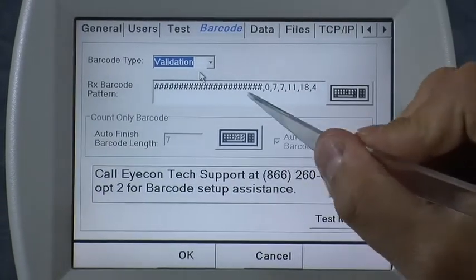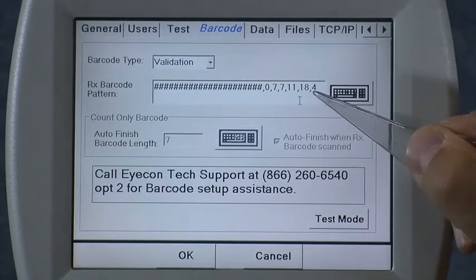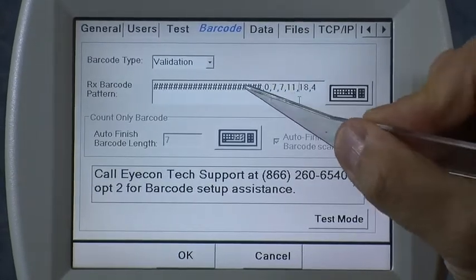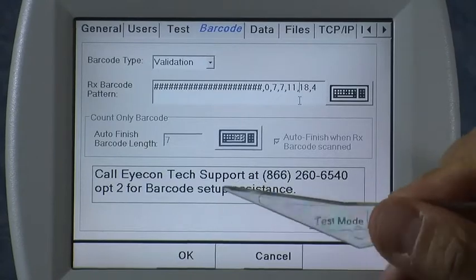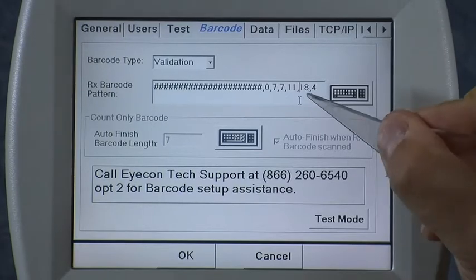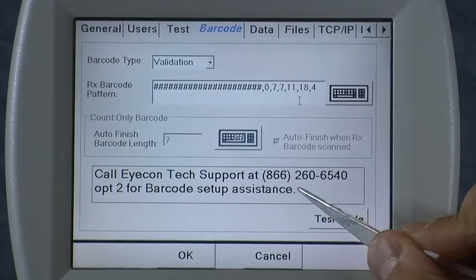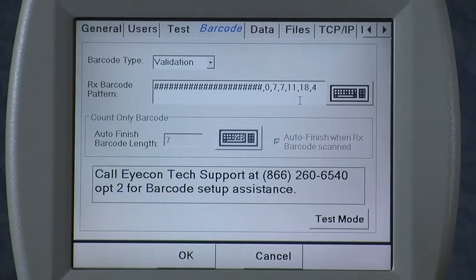When you select that, the next box here shows the Rx barcode pattern, which tells the icon how to interpret which of those numbers is located where within that long barcode. Typically when you're going to set that up, you will simply call icon tech support at this number and we'll walk you through the process. We're familiar with the different software systems and we can figure one out from scratch if we need to.